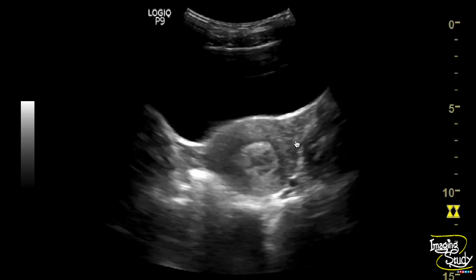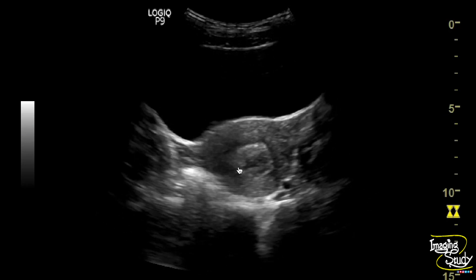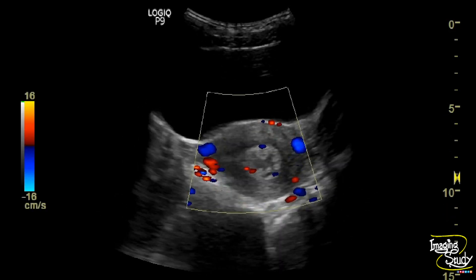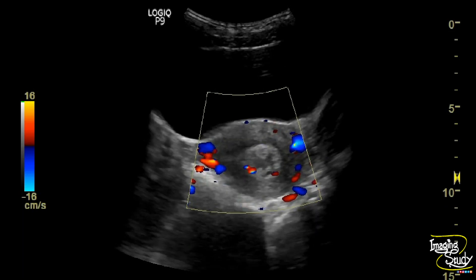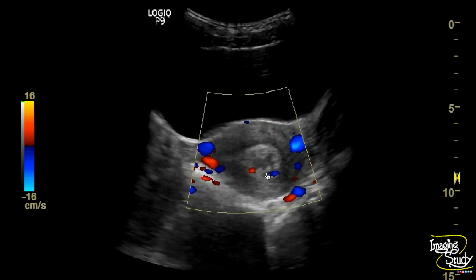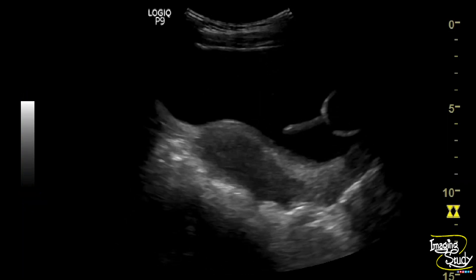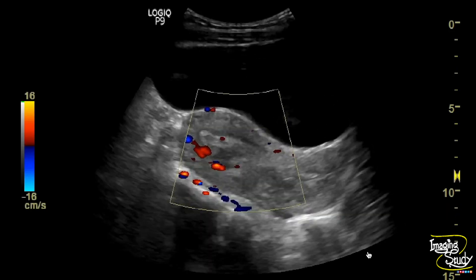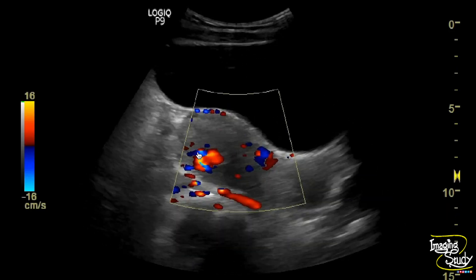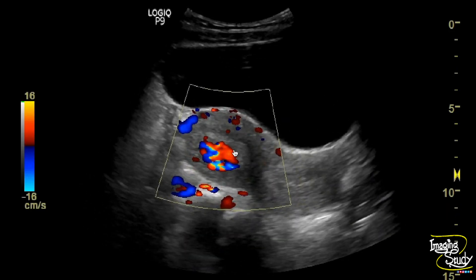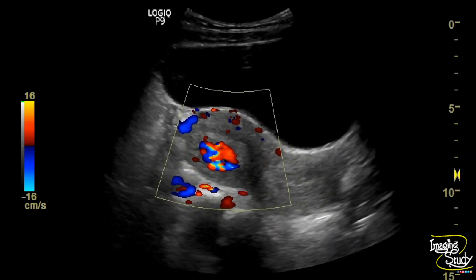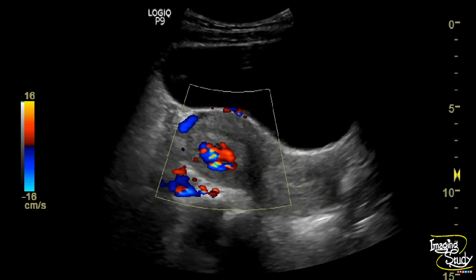On the transverse section, you can see the heterogeneous area quite well. On color Doppler, you can see a good amount of flow towards this heterogeneously hyperechoic area, indicating the presence of trophoblastic tissue. You can see a prominent blood supply on the longitudinal section, indicating the presence of trophoblastic tissue within the uterine cavity.